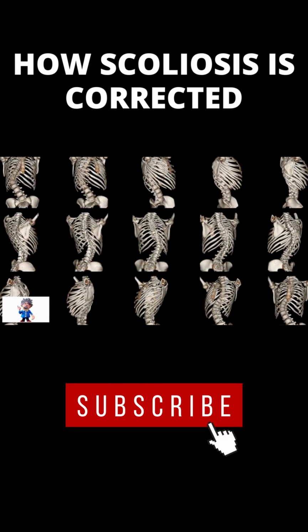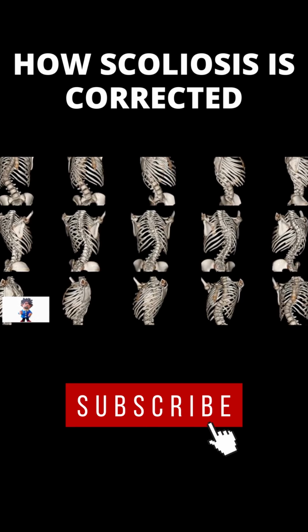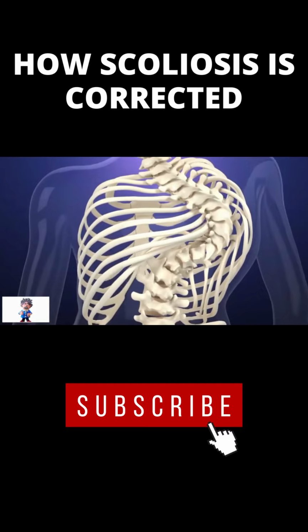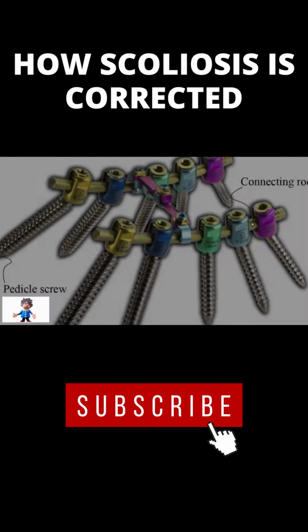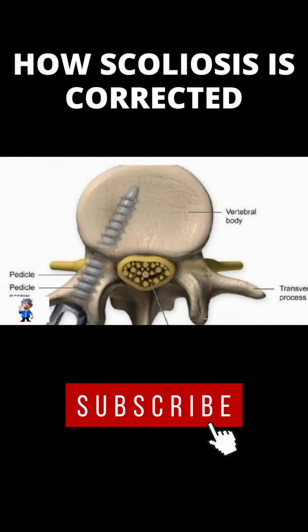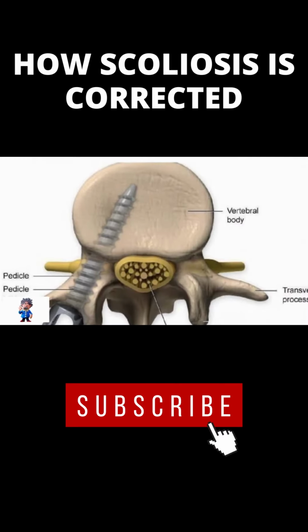The most common type of scoliosis surgery is the posterior approach, where the surgeon accesses the spinal column through the patient's back. The procedure involves spinal instrumentation, such as rods, hooks, and screws, to straighten the curved spine and hold it in place.